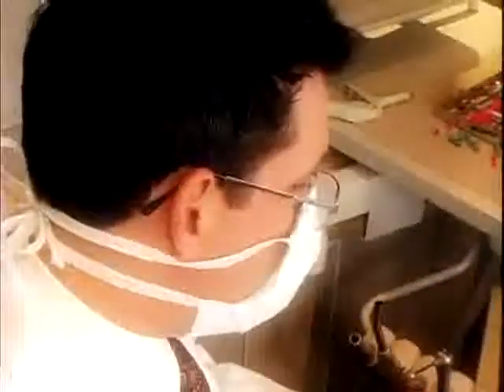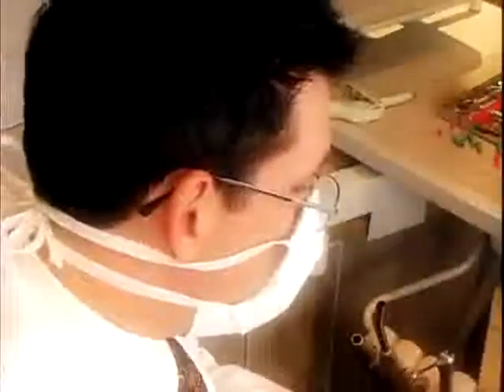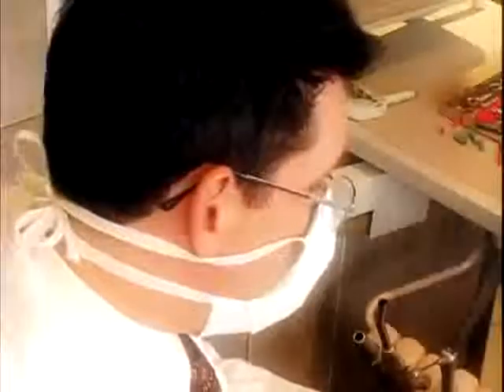All right, so that concludes our simulation. What do you think? Want to stick with the befores, or is it time for a change? No, I think it's definitely time to change. Okay, let's take some impressions and get started. All right.